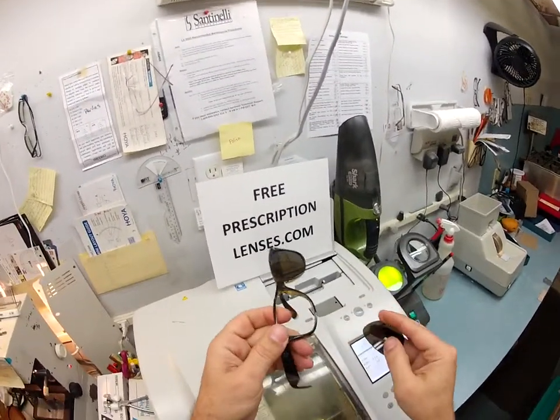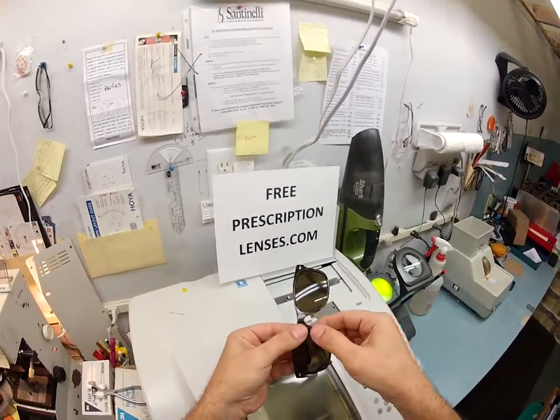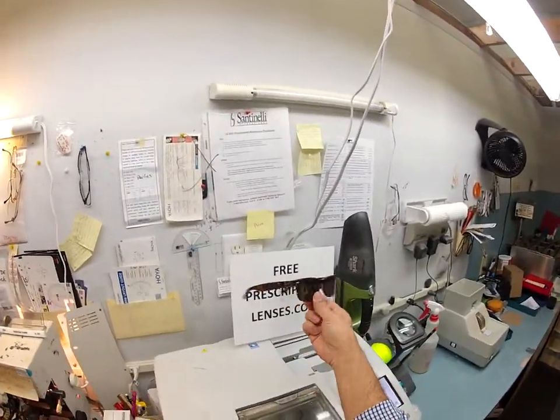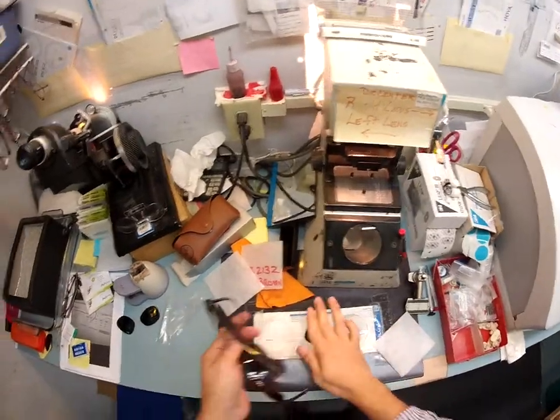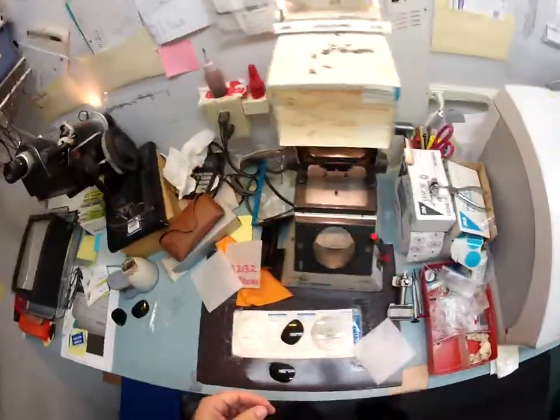And to put it back in, I rotate the frame upright, and I tuck it in at the outside corner closest to me, and then with my thumbs, press right down, and there you go. You've got your brown sunglass lenses and your tortoise frames. So let me pop these back out. I turn it downward, and I push down with my thumb. Out it comes. Let me clean these back up.